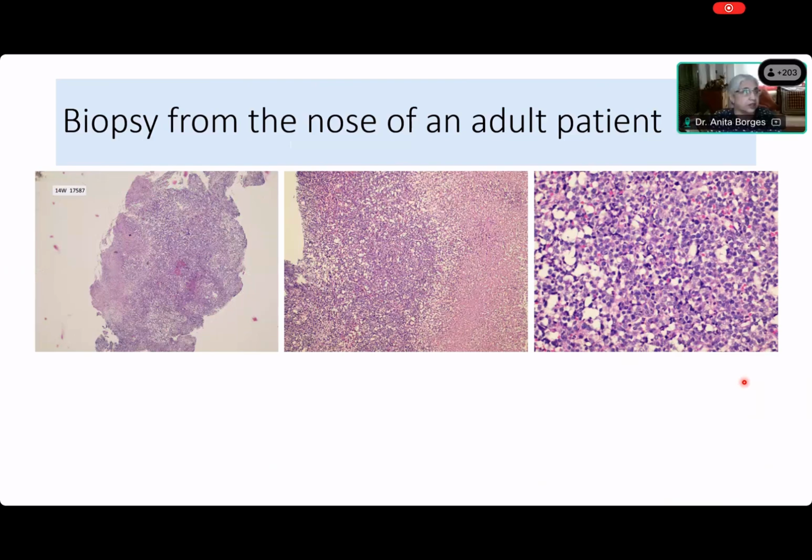Sneha? Yes, ma'am. Very good. Now, ma'am, does this qualify for a poorly differentiated malignant tumor? Do you see any differentiation in this at all? No, ma'am. No. So, in layman's terms, in the way that we often think about it, what can we say, that this is a tumor that is in sheets? Yes, you can see that it is in sheets. There is no differentiation at all.